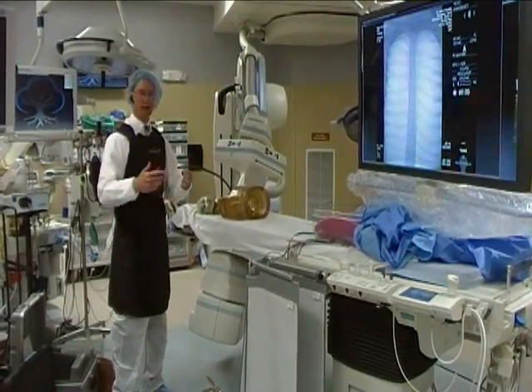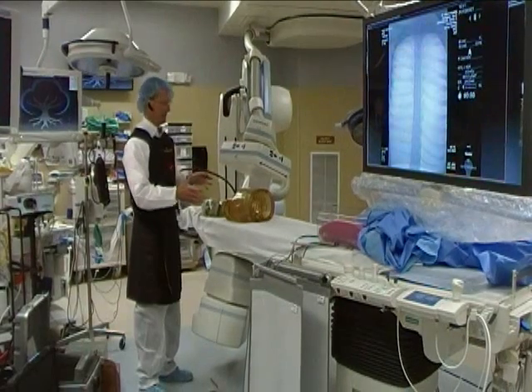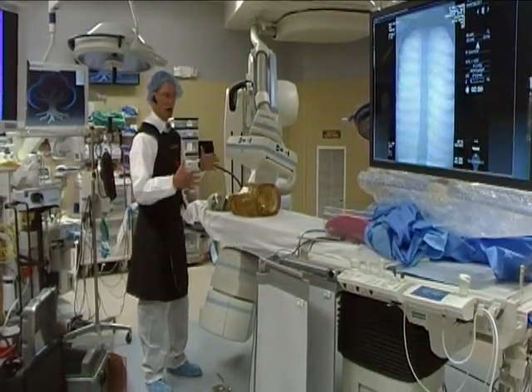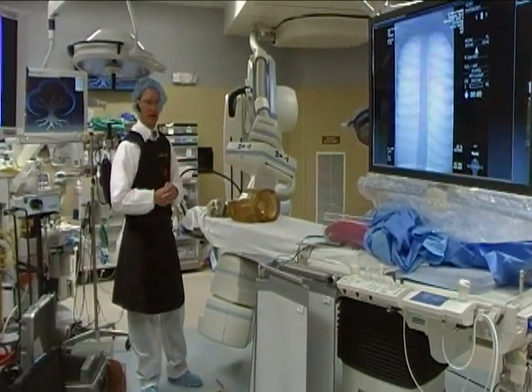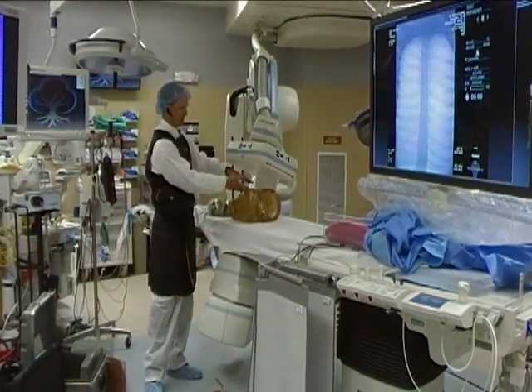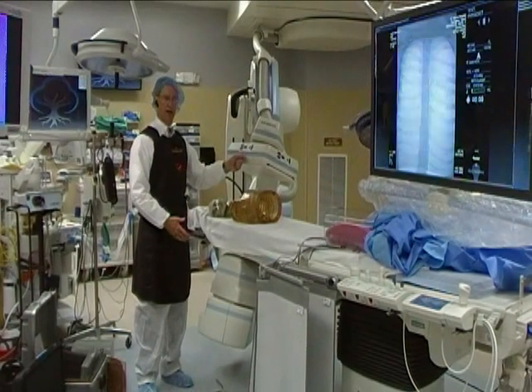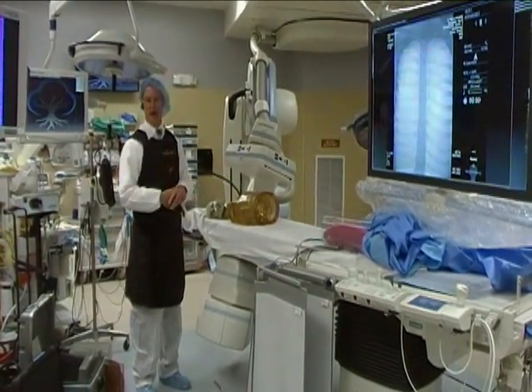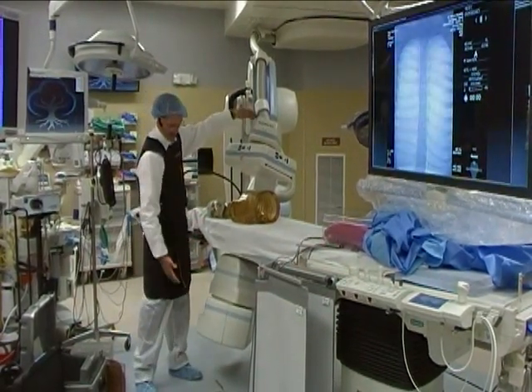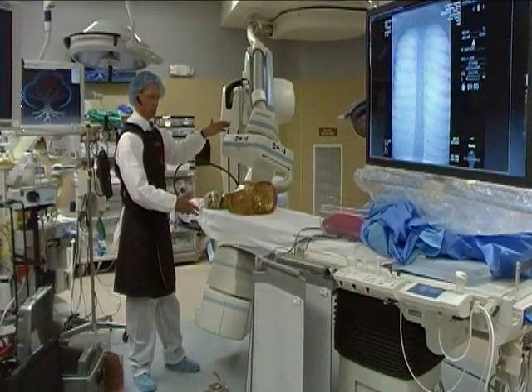Things that affect the amount of radiation that comes off the patient: how much radiation the patient gets is the number one thing. And the thing that controls that is how big the patient is. Larger patients will have much more scatter radiation than smaller patients. The distance: the further this image intensifier gets above the patient, the further it gets from the tube, the harder the tube has to work to make the images, and therefore will make more scatter radiation. So as this gets up in an angulation like this, the SID gets longer than when it was in the AP view. So this is going to cause more scatter.